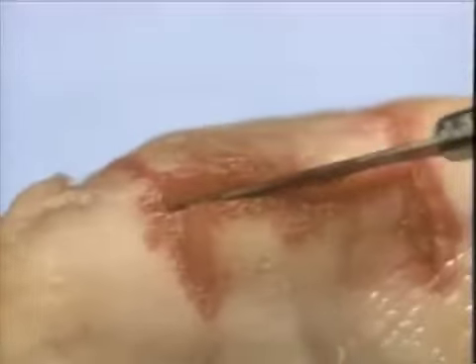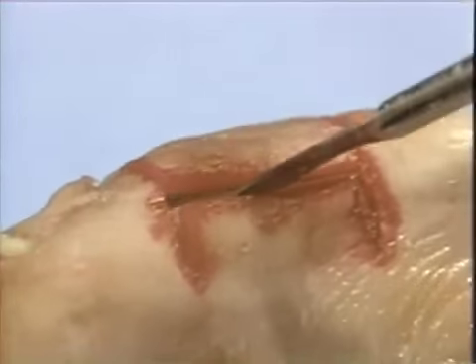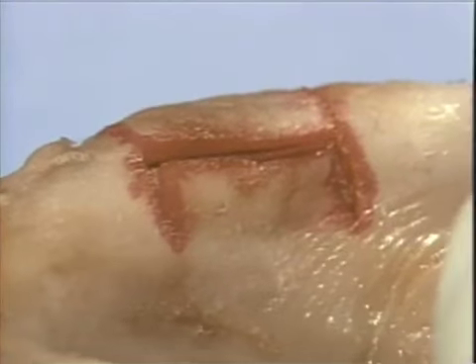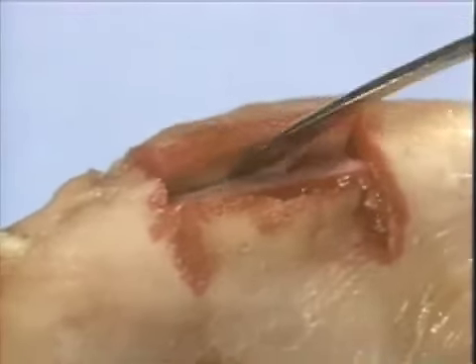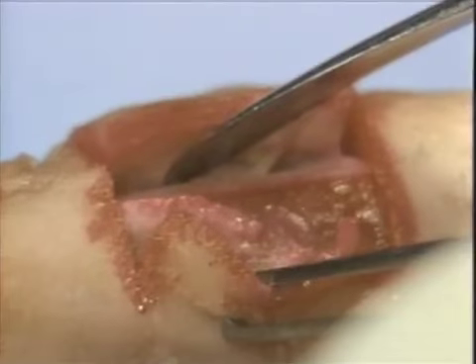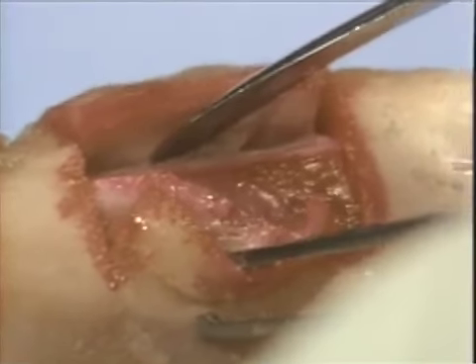We will now make an incision below the periosteum to demonstrate the difference between a full thickness flap on the buccal and a split thickness flap on the lingual. The split thickness flap is ideally suited in production of the apically positioned flap where pocket reduction is anticipated.